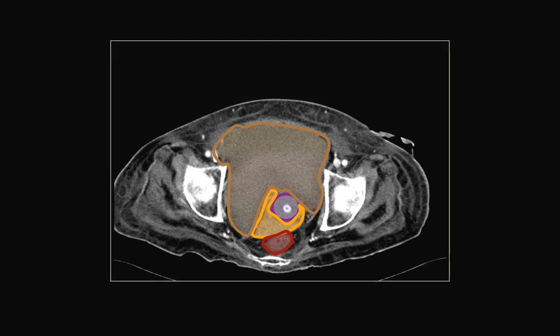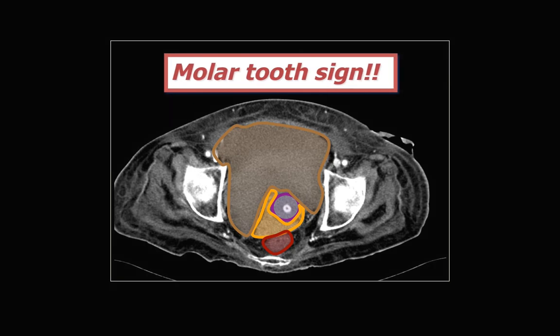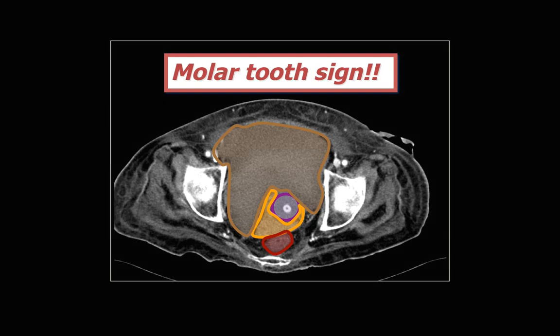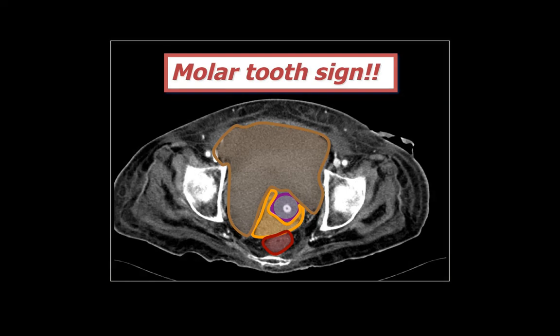And notice the shape of this collection that fits a molar tooth appearance. This is what's known as the molar tooth sign, which is a sign of extraperitoneal pelvic fluid within the pre-vesicle space.